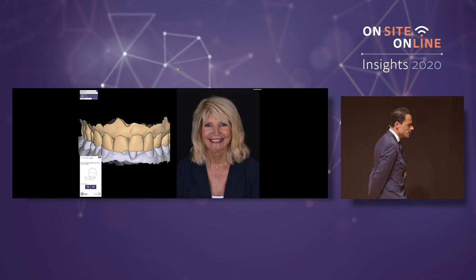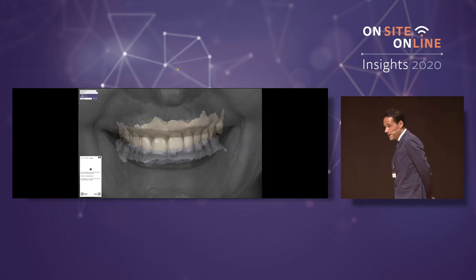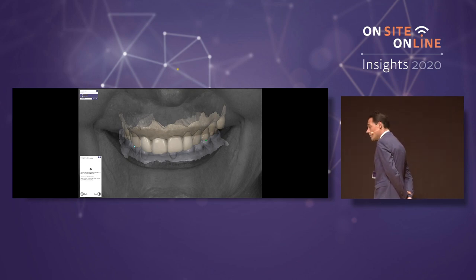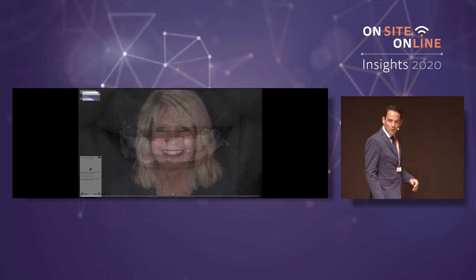Two points, I align the upper jaw with the picture of the patient, I rotate it. I like to use the outline view because it is very helpful for me to value that the position of this model is precise. I need to have a good connection, a perfect connection, otherwise my decisions will be incorrect. This is perfect, go on. The pupillar plane is going to be the reference plane. Go on with the smile design, with the proportions guide.